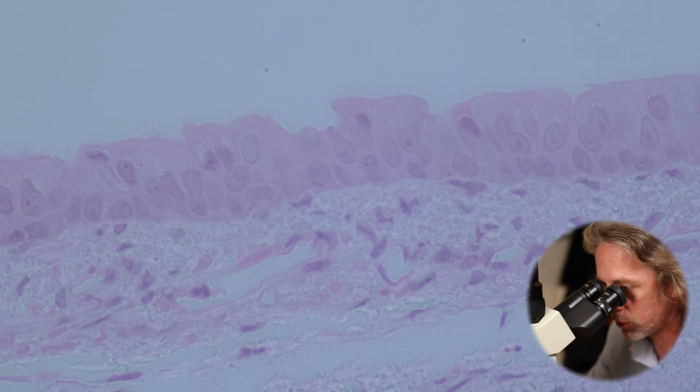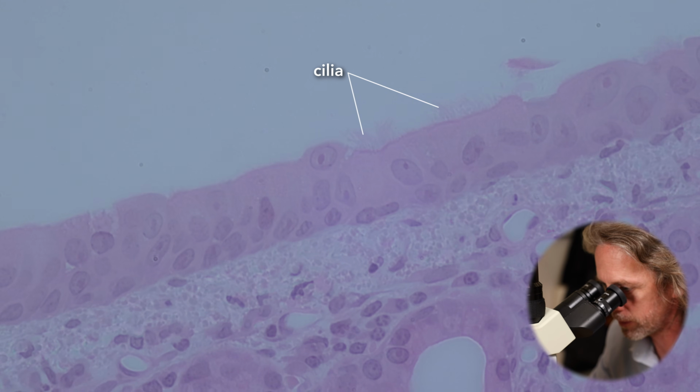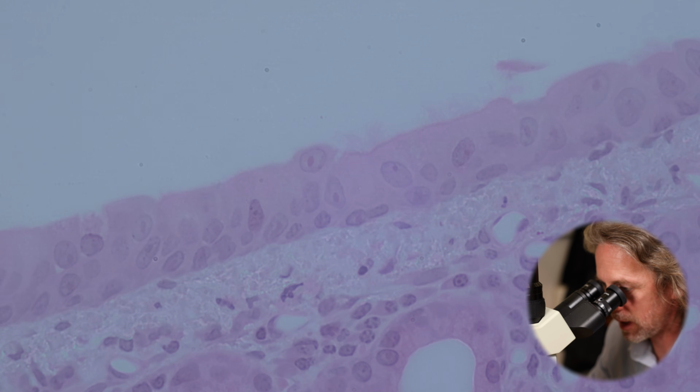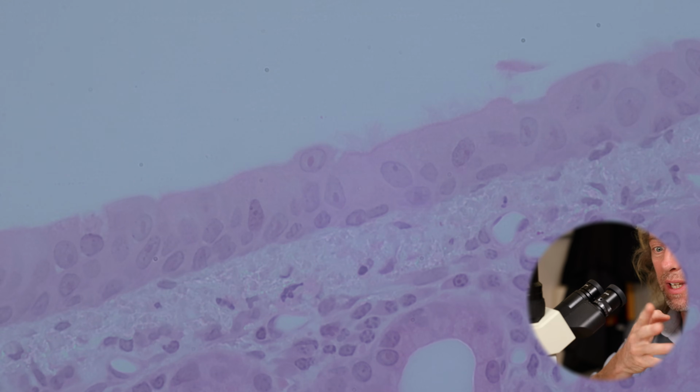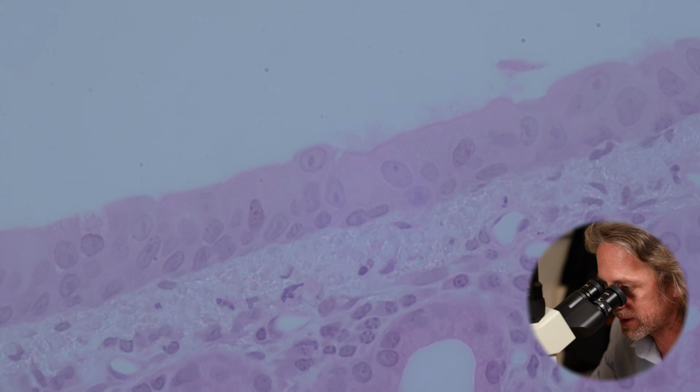You can just about see that pinkening edge, or I can. That looks pretty believable. So there are cilia coming from these epithelial cells. Cilia are little appendages from the cell, and they can be moved by the cell. And this gives us the mucociliary escalator.